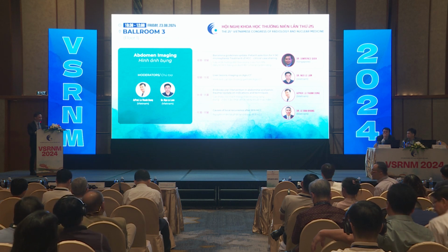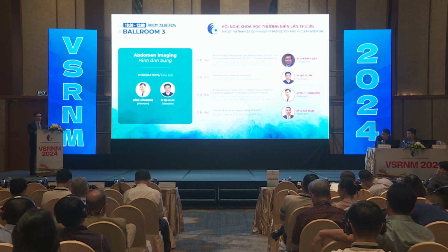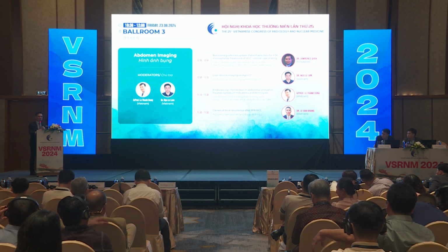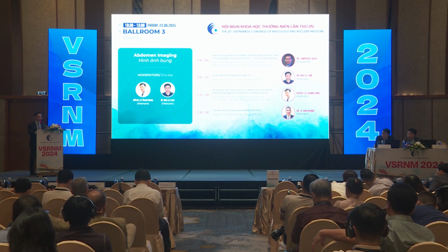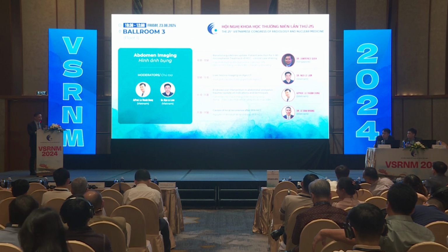If it's radiation segmentectomy, more TheraSphere. But there's recent evidence, just published either this year or last year by Kokabi, that basically showed that the results for radiation segmentectomy with resin microspheres are just as good. So both can be used for radiation segmentectomy, and there's no bias towards one or the other in terms of literature. But in terms of practice, we tend to use more glass microspheres for radiation segmentectomy, and resin more for palliative lobar infusion.